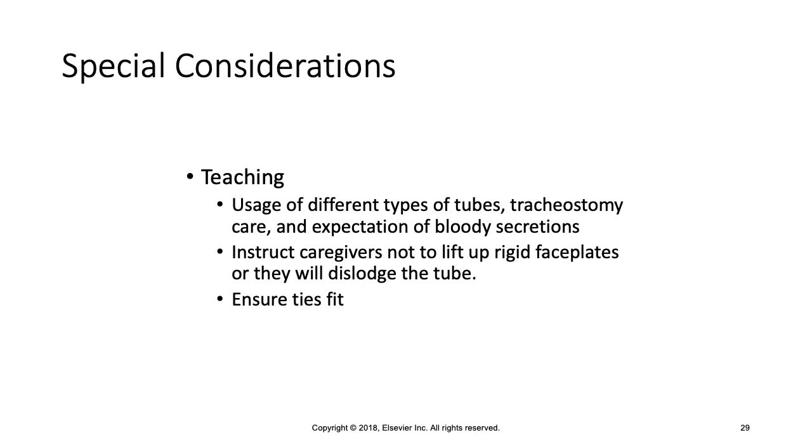Caregivers are not to lift up faceplates that are rigid because they can dislodge the tube. So just be careful. Don't move that around. Usually you just take a Q-tip and go around it, and make sure that the ties are snug enough to keep the tube in, but not too snug as to put any undue pressure on the skin and cause an ulcer. You should be able to get 1 to 2 fingers under those ties. And we'll show you how to do that in lab.